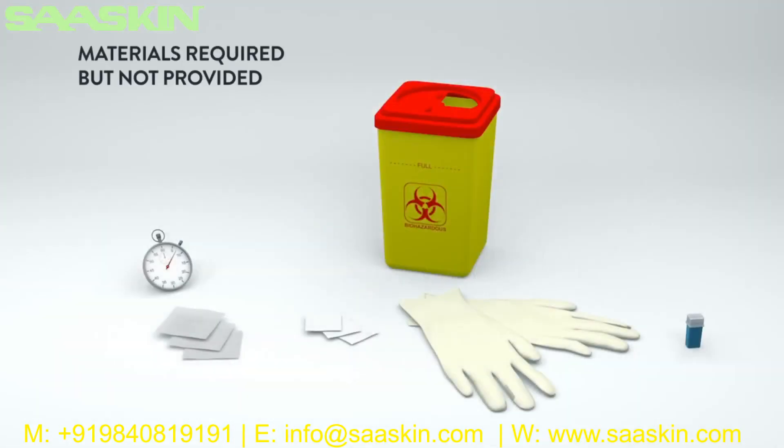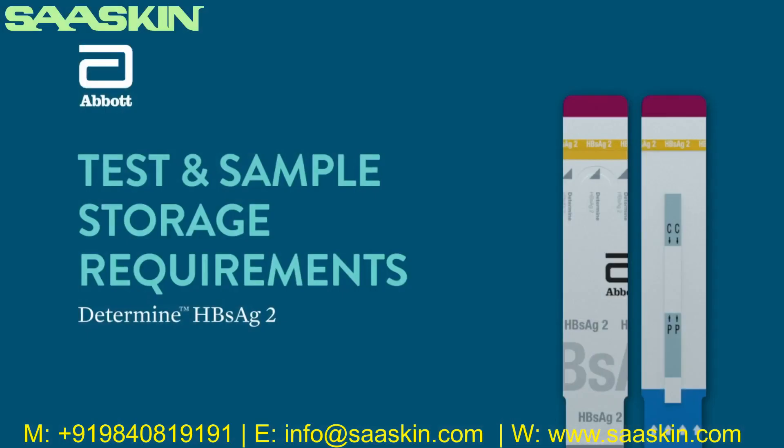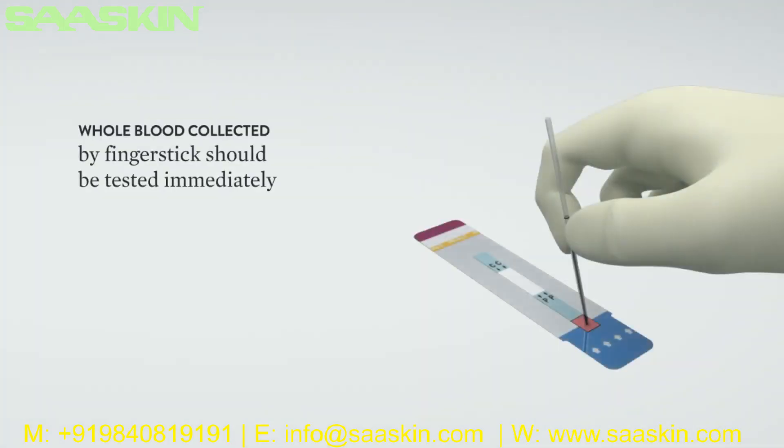Materials required but not provided: clock, watch, or other timing device; a sterile lancet capable of producing 50 microliters of blood; disposable gloves; sterile gauze; antiseptic wipes; and a biohazard disposal container. Test and sample storage requirements: The test cards in the aluminum Ziploc pouch containing desiccant and the chase buffer must be stored at 2 to 30 degrees Celsius (36 to 86 degrees Fahrenheit) until expiration date. Whole blood collected by finger stick should be tested immediately.